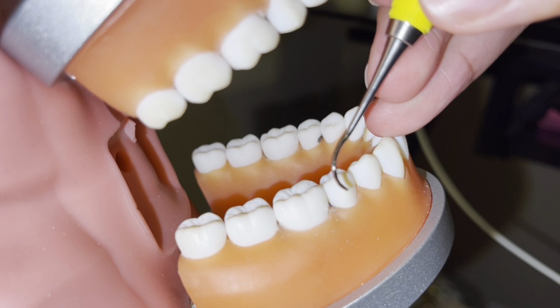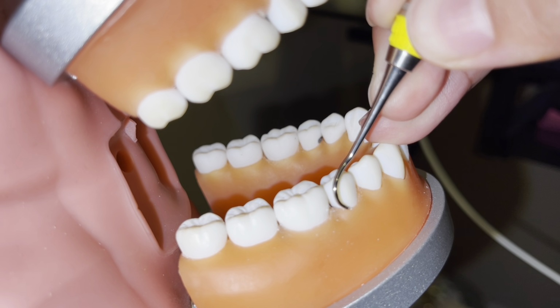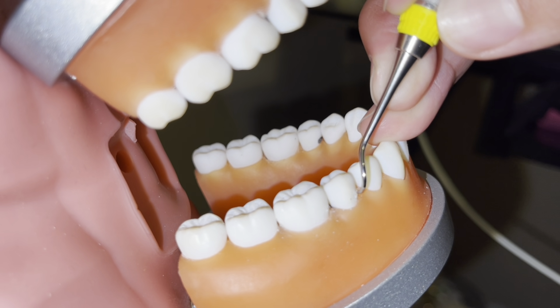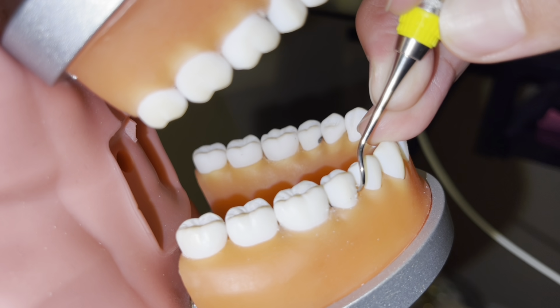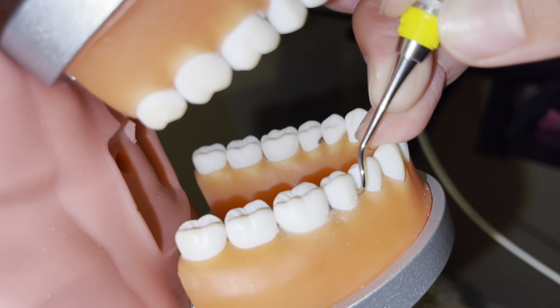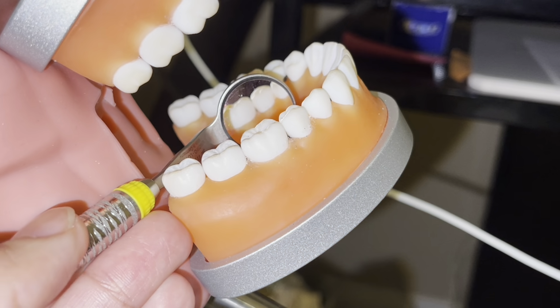Walk across the facial aspect, side to side, pivot roll, side to side, pivot roll, and maintain a 70 to 80 degree face to the tooth surface angulation, and in the proximal, up, down, lateral strokes.